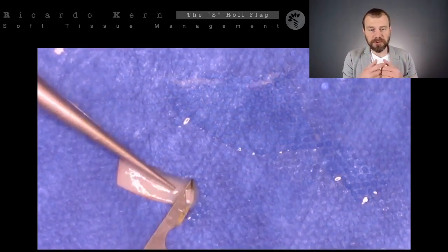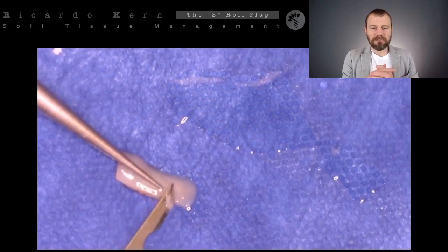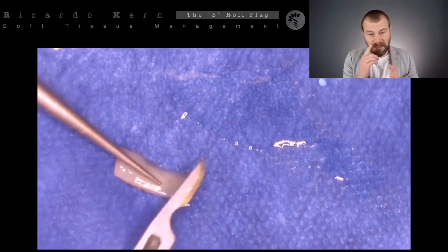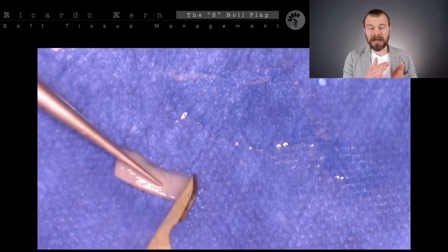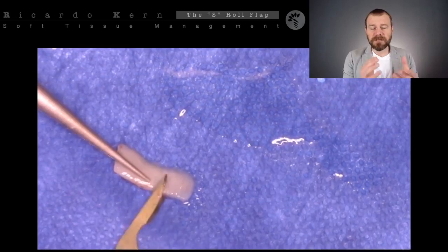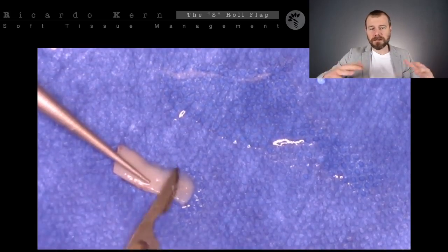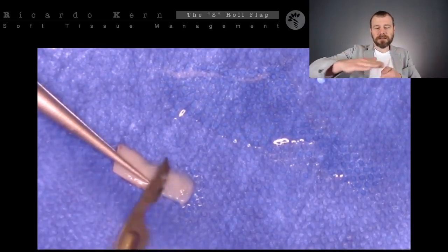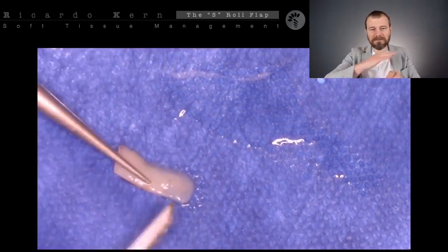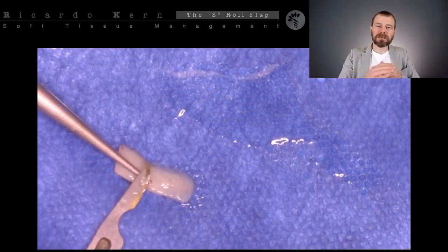I am used to doing this job, and I think the main deal about doing the deepithelialization outside the mouth is to have a steady surface to work on. Never do that over gauze. With a lot of gauze, the surface is completely soft. You cannot have the grip to properly do the deepithelialization.